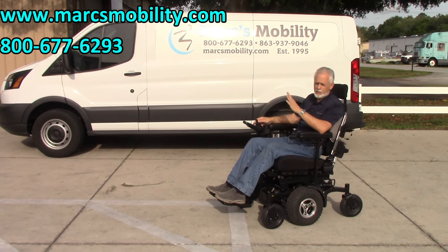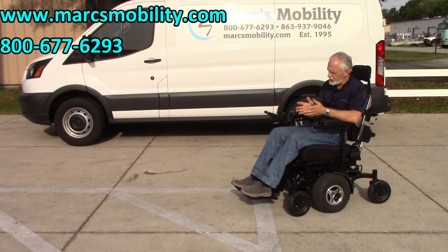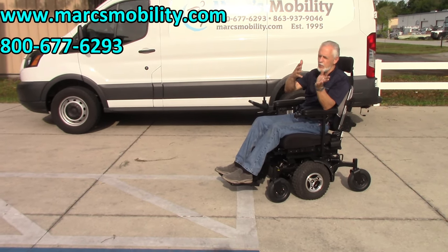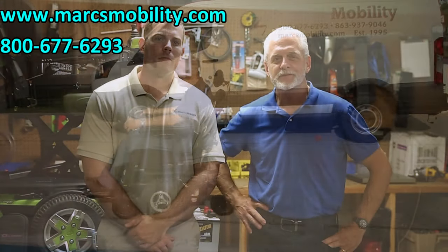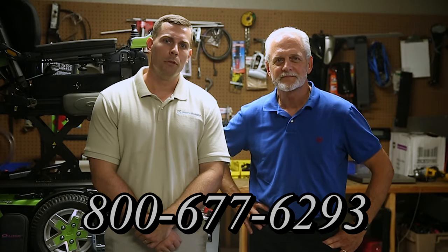So let's recap. This is one of my favorite chairs of all time — the Magic Mobility Frontier V6 power chair. It has the 12-inch seat lift, electric tilt, electric recline, electric legs, swing-away joystick, low-pressure 14-inch tires, retractable belt, and fantastic suspension. If you want a chair and want to have a lot of fun, this is the chair. I'm Mark and my name is Alex — we are a family-owned business for over 25 years with many products available. Call us at 800-677-6293 or visit www.marcsmobility.com.